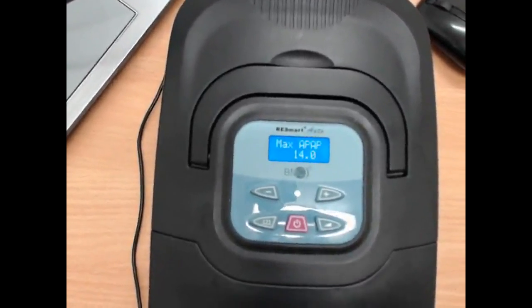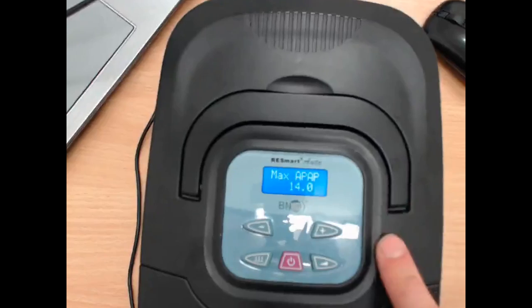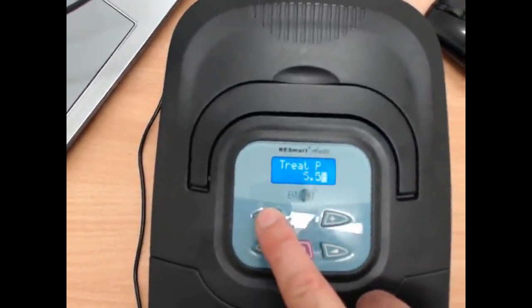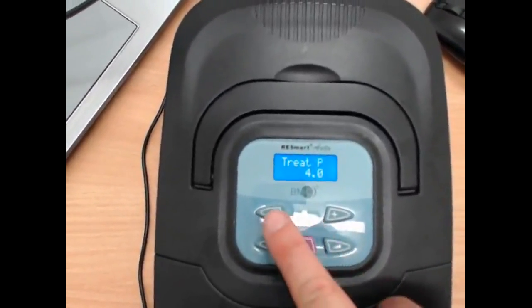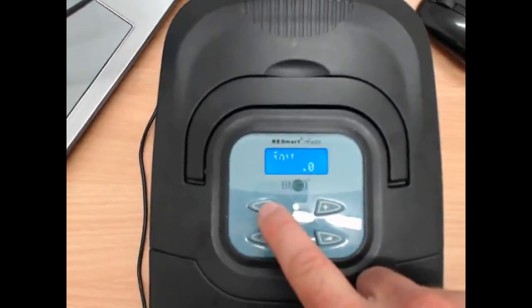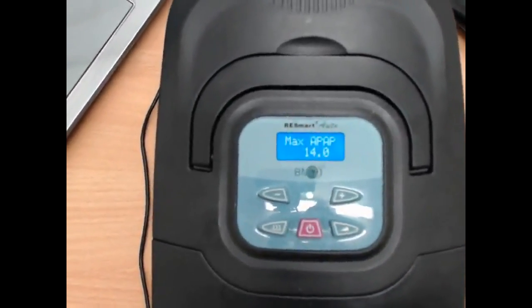If you want to, you can basically just have it so that the initial pressure and the treatment pressure are the same. So we have them at 4 and then initial pressure at 4. That just means that basically the machine's going to go between 4 and 14.